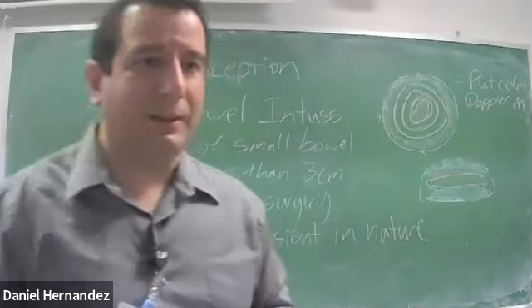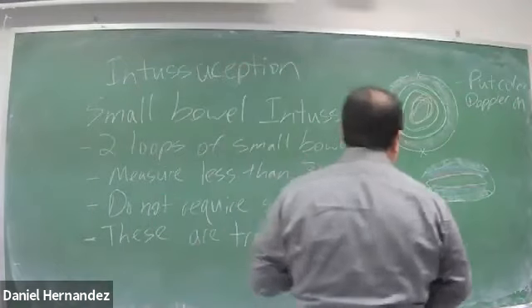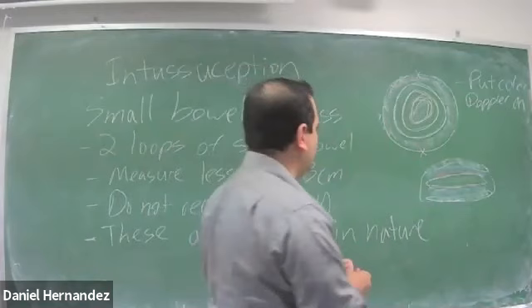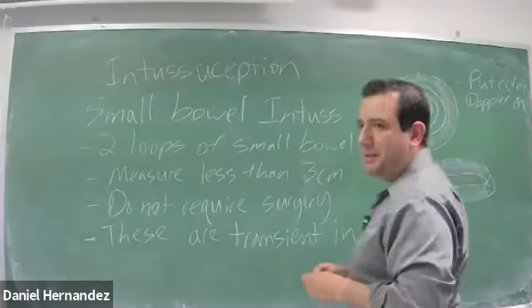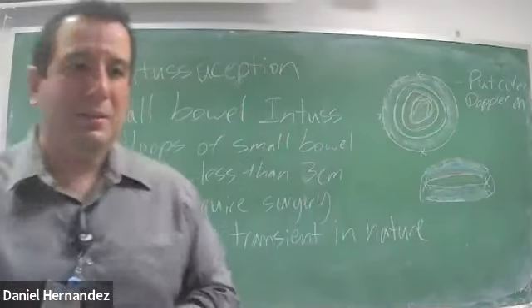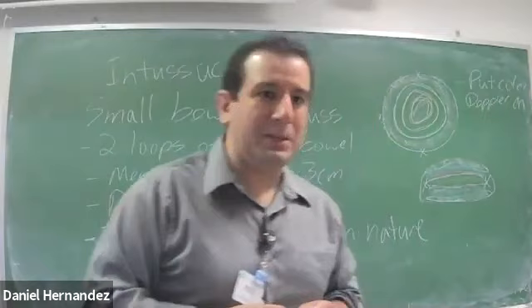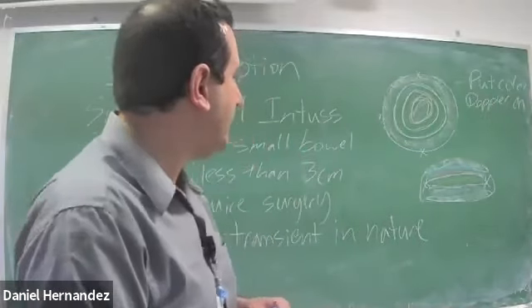Look kind of something like that. So you'll get a diameter measurement, and then you'll try and get as best you can a longitudinal measurement. So you'll try and measure how long of a segment is intussuscepted. That'll also help the radiologist to determine how difficult this could potentially be to reduce doing that air enema procedure.